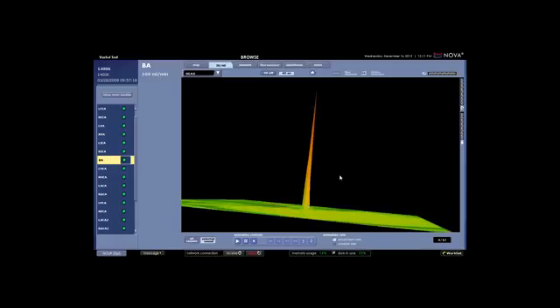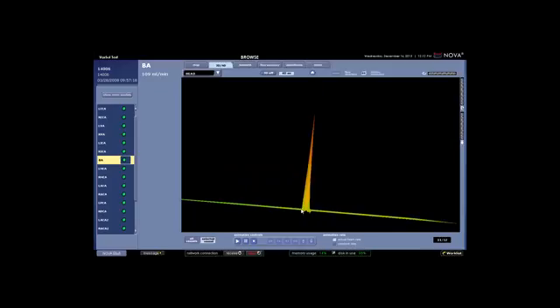And then at the edge here, at the border of the vessel wall, we can appreciate the vascular response in the vessel wall itself. So you see we have actually sort of a W-shaped waveform here, where we're picking up flow in the vessel wall, which would potentially be very useful with this kind of time resolution, or even higher time resolution, to look at vessel wall distensibility.